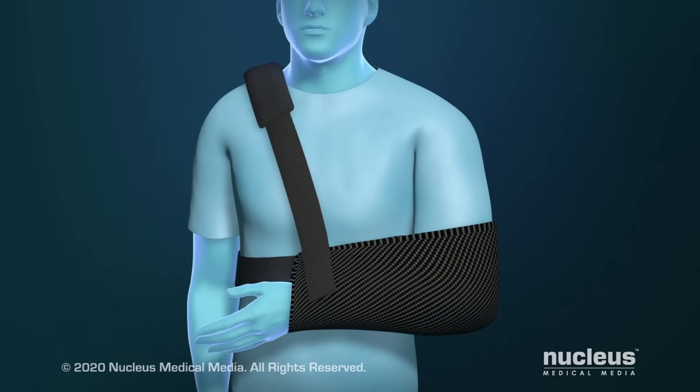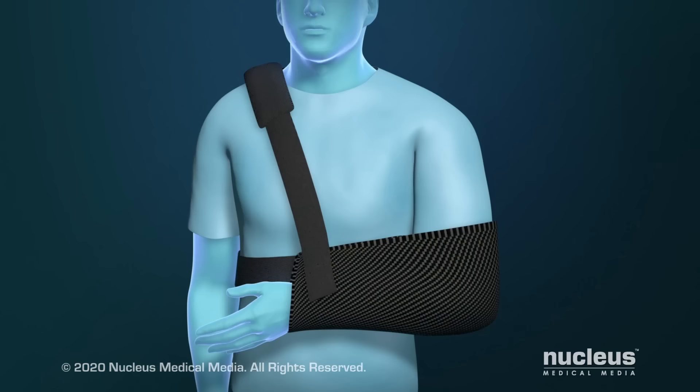After the procedure, you will need to wear a sling on your arm for a few weeks while your shoulder heals. For more information about a total shoulder replacement, talk to your healthcare provider.